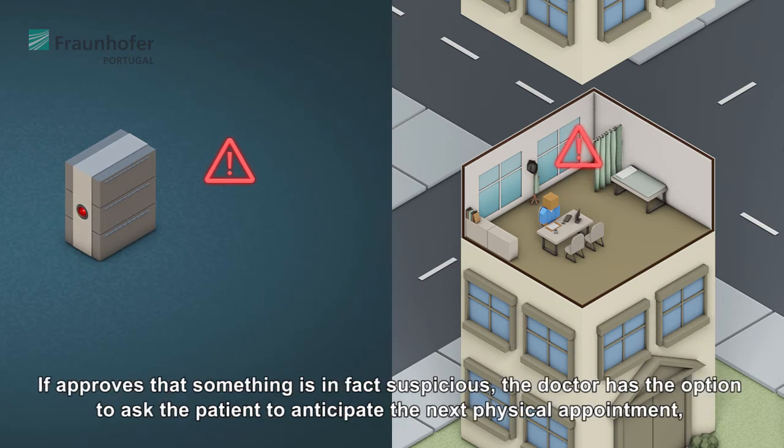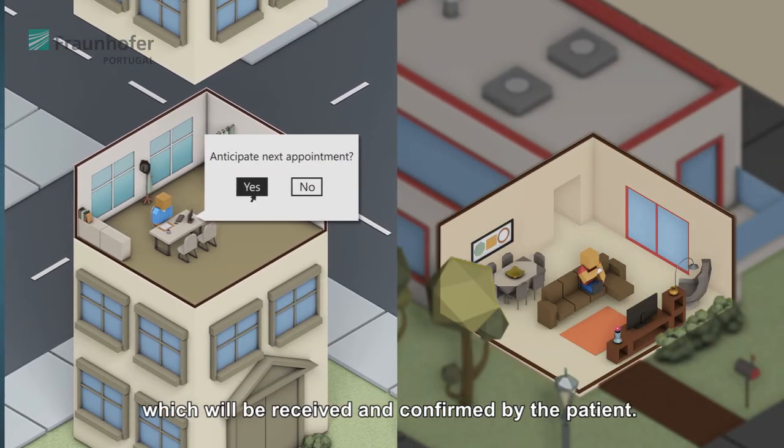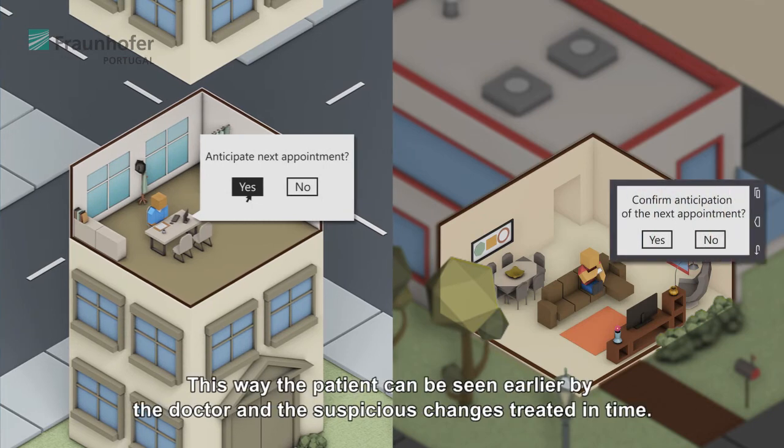If it proves that something is in fact suspicious, the doctor has the option to ask the patient to anticipate the next physical appointment, which will be received and confirmed by the patient. This way, the patient can be seen earlier by the doctor and the suspicious changes treated in time.